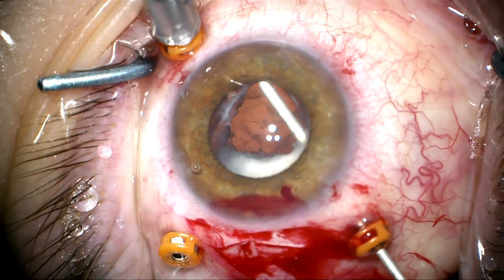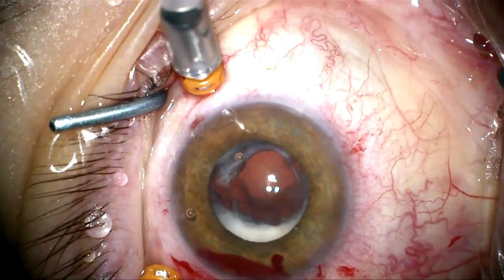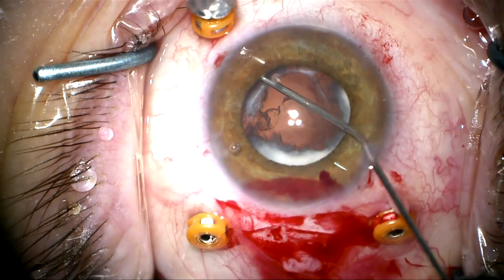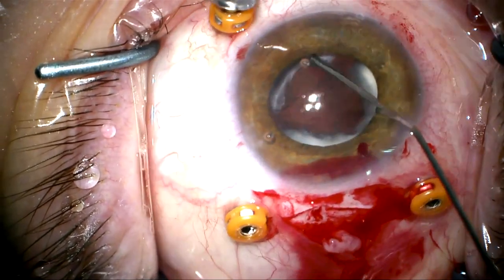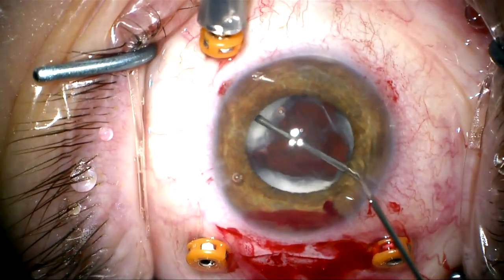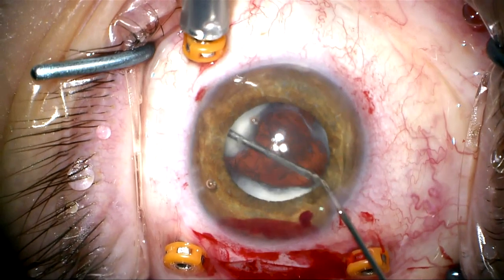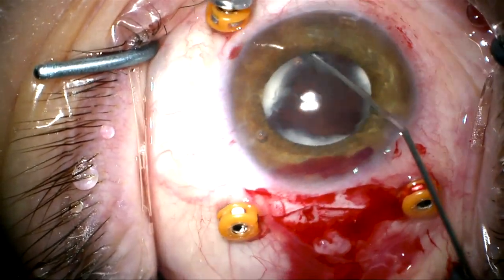I'm going into the space between the anterior and posterior capsule with the vitrector using vacuum only. I can feel that the Soemmering's ring is still tightly socked in, so we're going to use some more viscoelastic to try to loosen that up. I can see it's starting to loosen up a little bit where I can maybe get it out of the capsule recess.